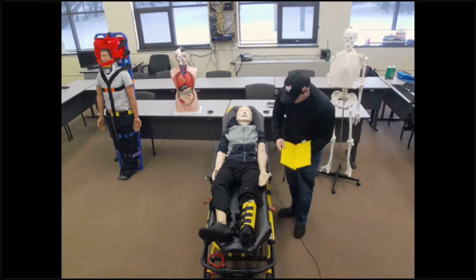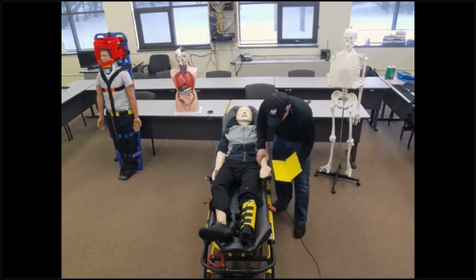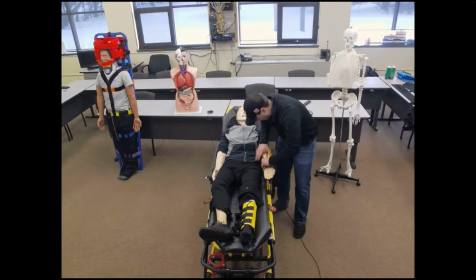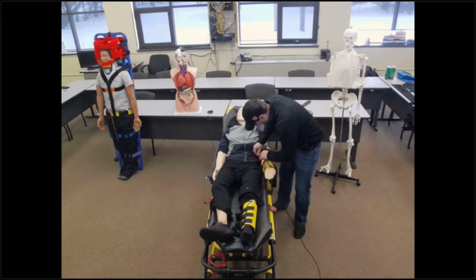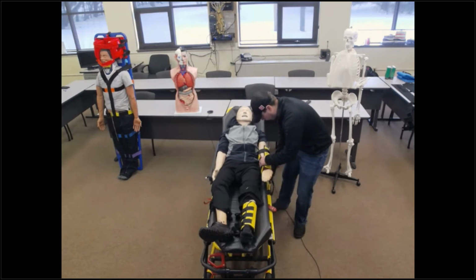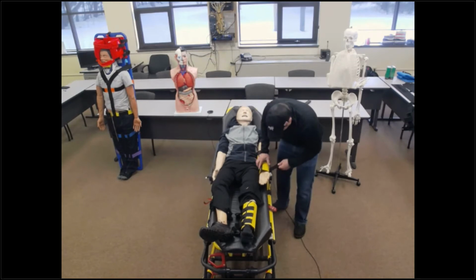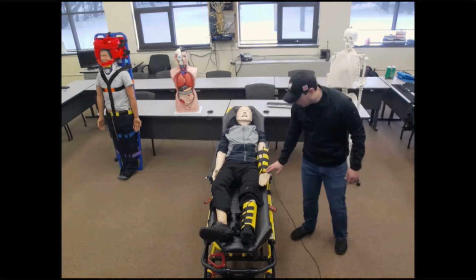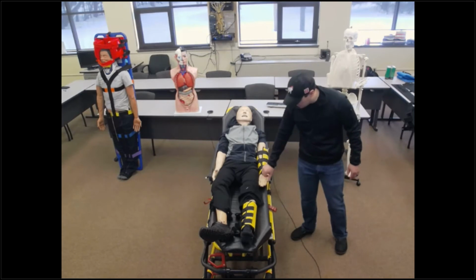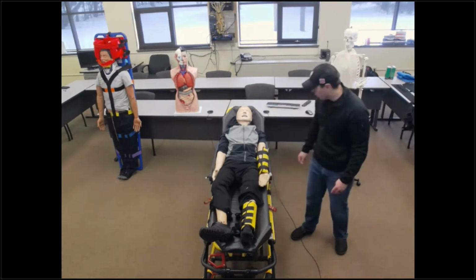So open that up. My partner might be able to assist with this. Nice and gentle. Wrap that around your patient and go ahead and secure it in place with your Velcro straps. Okay, I got that attached. Go ahead and check CMS. I'm checking for a pulse. Which finger am I touching? Go ahead and wiggle your fingers.